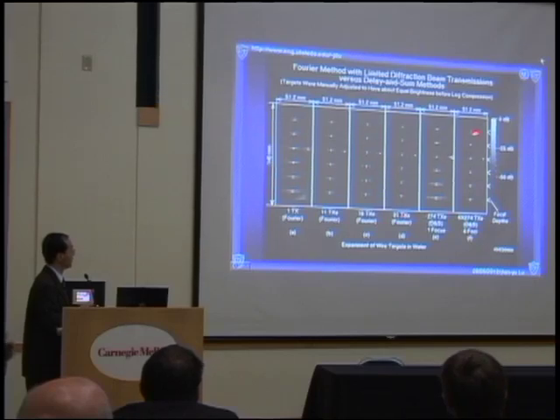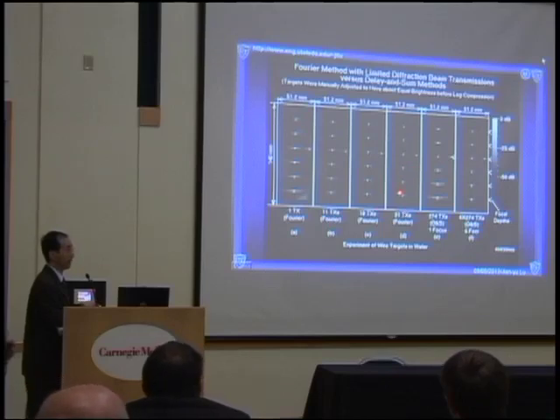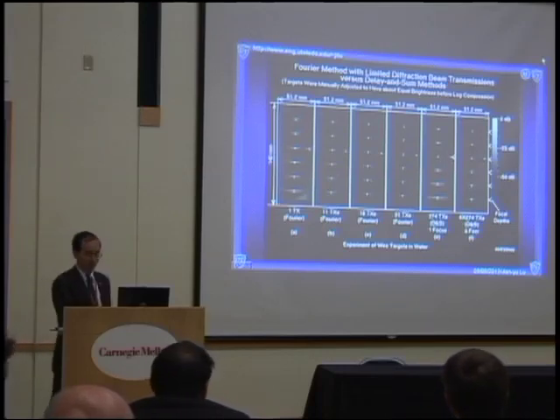But with the conventional focused beam, we can focus here and then diverge at other distances, then refocus to this distance, cut a piece of image and put it here, and do this one by one, 6 times. Each time we use 274 transmissions to reconstruct images. Then we get a result similar to this 91 transmission result, which uses plane wave and Fourier transformation to reconstruct images. So they are very similar, but this has an advantage, as I mentioned before.